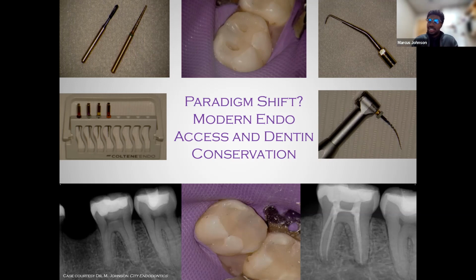A full coverage restoration is still recommended, but nonetheless, now having that truss intact, you can see I was able to get into the dentinal bridge there, the furcational bridge, clean that space out, obviously with the ultrasonic, and I think I'll show a video of how I was able to compensate for that.